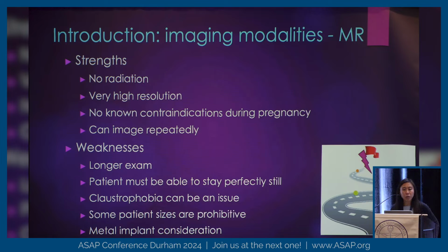These days, we do have faster sequences. We have some techniques where you can get one or two sequences and then the computer can generate the other sequences that we used to actually have to obtain one after the other. So you can get it down as quick as maybe 6 to 10 minutes, but it's still not a minute's worth of imaging. Claustrophobia is a real concern.